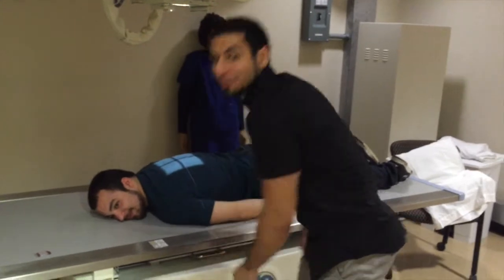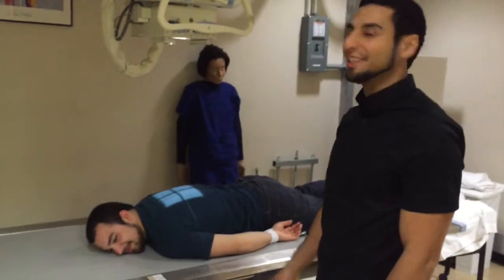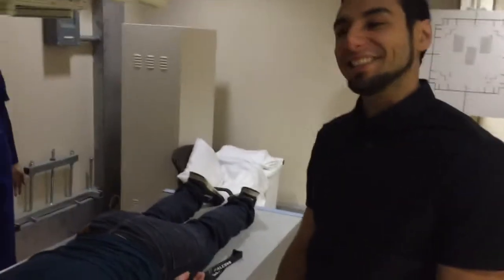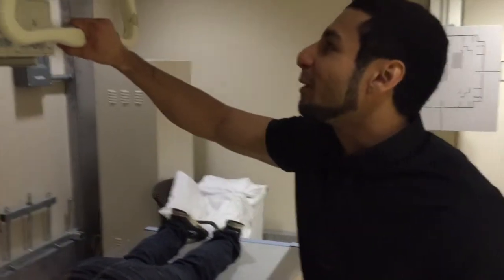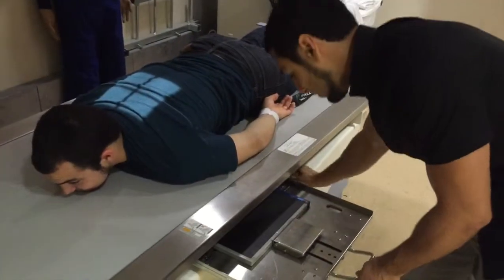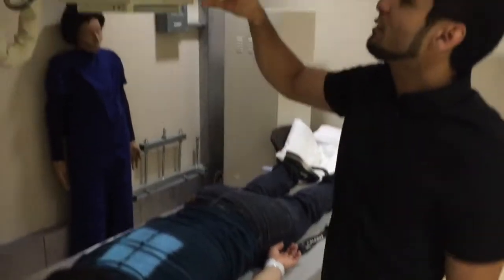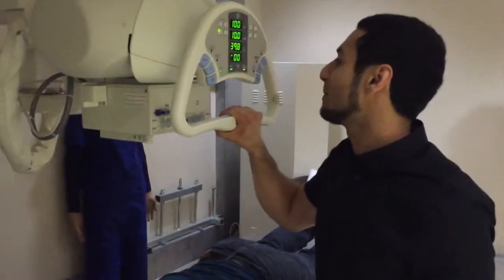Hello there! My name's Sai. I'm doing a parietoacanthial projection, otherwise known as a Waters projection, on my friend here. He's not really my friend. We want to demonstrate foreign bodies in the eyeballs and the eye sockets, tripod and Le Fort fractures as well. Before beginning, we want to make sure that our bucky is aligned to the tube, which it is not. So we have to make sure the line is centered. We want to have a 40-inch SID, or distance, from the bucky to the tube.